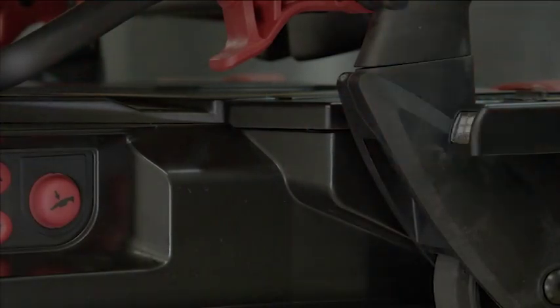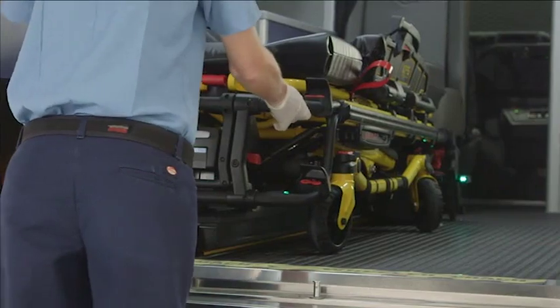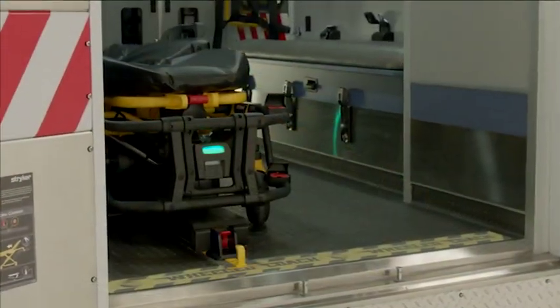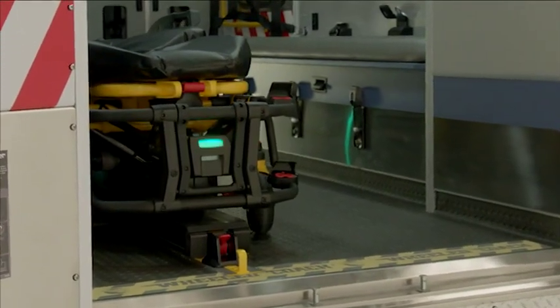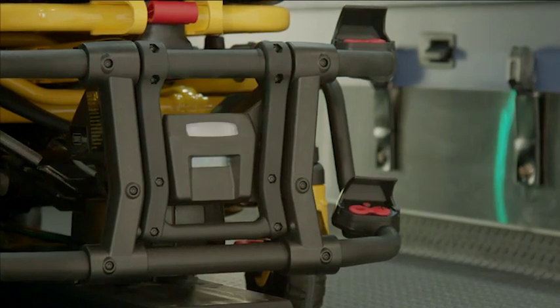Flashing amber indicates the cot is not in position or not ready for transport. Ensure that the cot is secure by firmly pulling side to side on the foot-end of the cot. PowerLoad automatically charges the PowerPro smart battery when the cot is in transport position. The battery indicator on the PowerPro cot will momentarily flash green to signify charging.